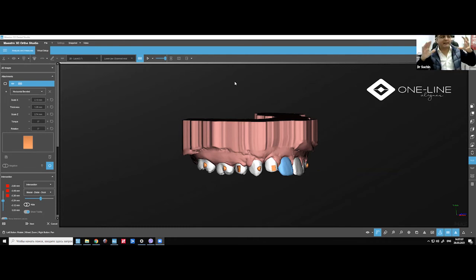So it's going to be at least maybe 50 or 60 combinations for every single tooth. What kind of attachment, which place. And then if Andrea can incorporate all those in the software, maybe yes. We need more AI. So if we think that every case is the same, no. You need to work on the surface area.